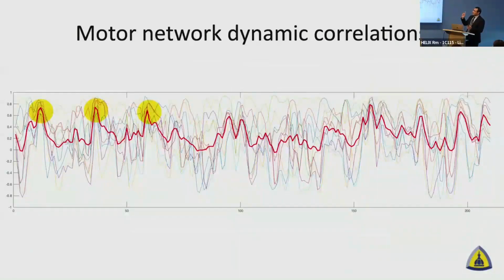It's because these brain networks are not always constantly active. They're engaging, dissipating, engaging, dissipating. So when you look at just the motor system, which is all these squiggly lines in the back, if I take the average of the connectivity, it's not that it's highly connected all the time, right? There are peaks and troughs. So there are time points where you have high connectivity, and time points where you have not as high connectivity, even within the motor system.